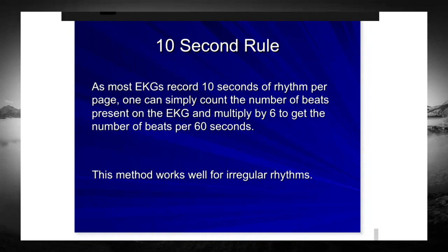How would I take their pulse? I know this sounds like it's that easy. Yeah, it is that easy. I promise you it is. I would touch their pulse, right? And then what do I do? Count for what, 15 seconds, right? Let's say I counted for 10 seconds. What would I have to do? Multiply by 6, right? Then I tell you how long this ECG is.